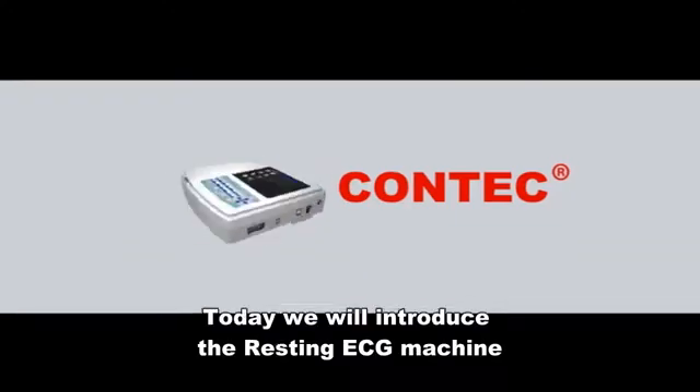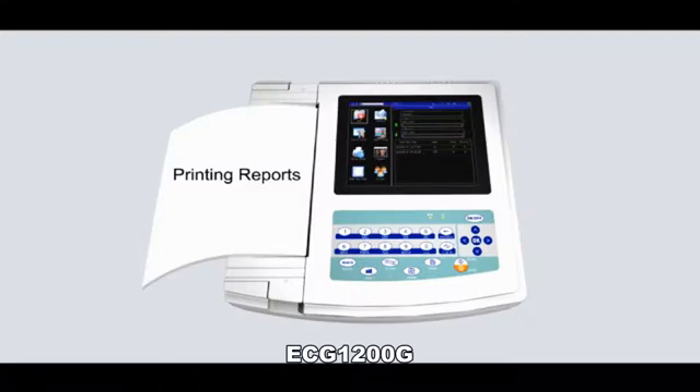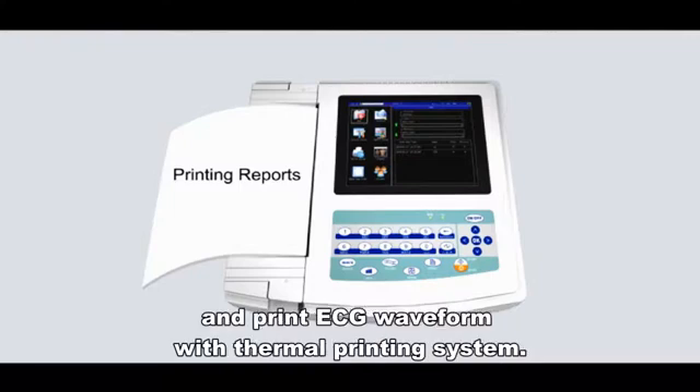Hello everyone. Today we will introduce the resting ECG machine, ECG 1200G. It is an electrocardiograph which can collect 12-lead ECG signals simultaneously and print ECG waveform with a thermal printing system.